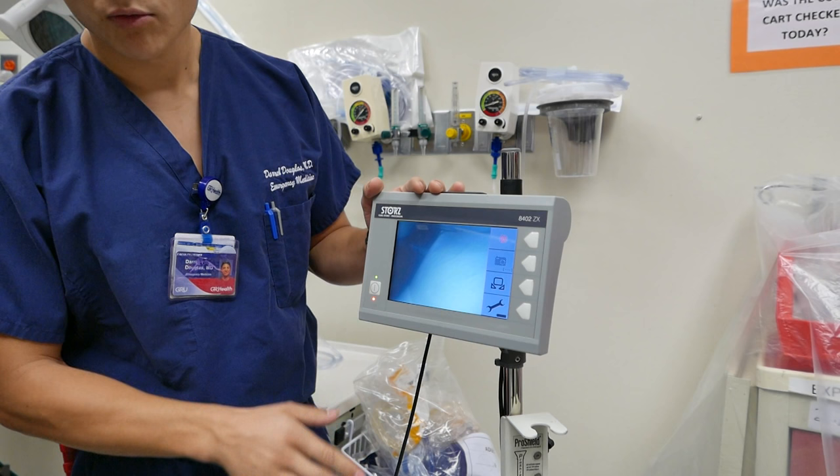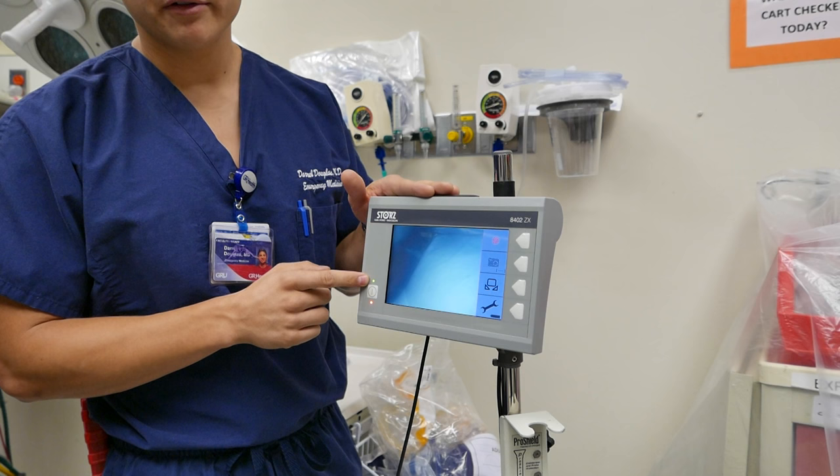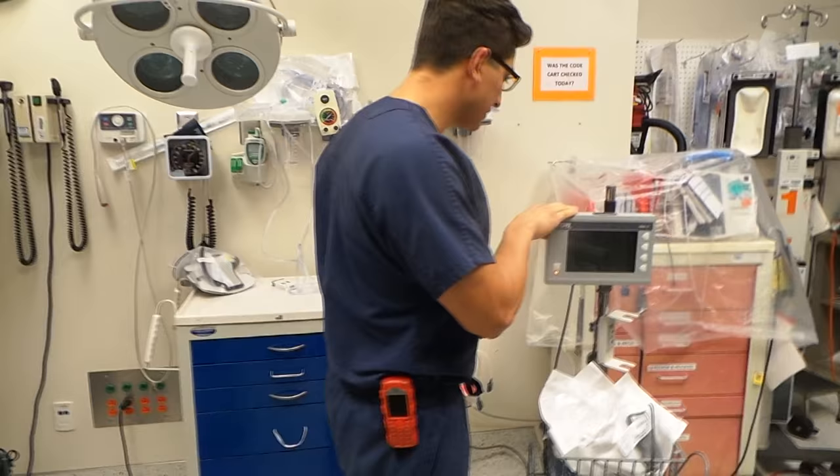Whether or not the actual device is connected, or the scope is connected, it will still turn on and you'll see this green light. If that green light is on, then that means the screen is trying to feed whatever information it's getting, whether or not there is actually a scope connected.